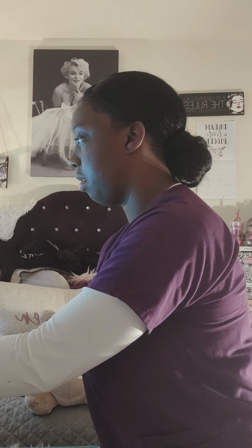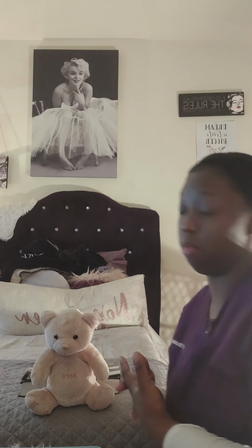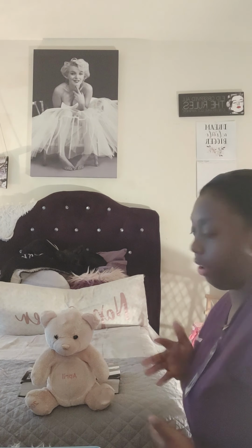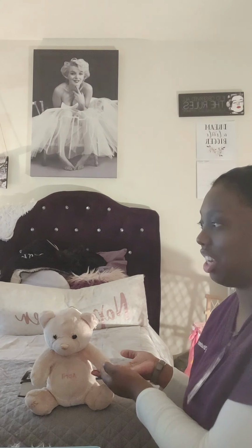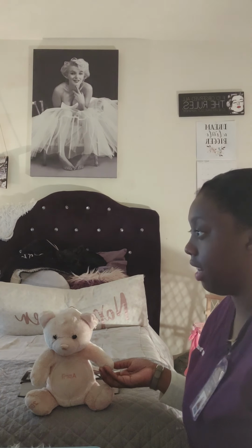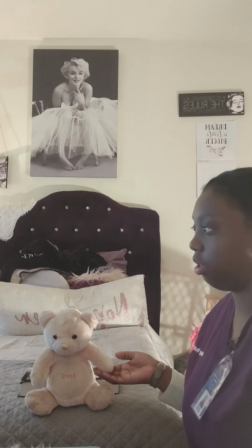Alright. So, normally I would have the patient lay their forearm on a table, but for the purpose of the video, I'm just going to hold it like this while I'm giving the injection. Alright, so when you're inspecting the area for the injection, you just want to make sure that the area is clean, there are no kinds of lesions there, just making sure that it's a good area to do the injection on.